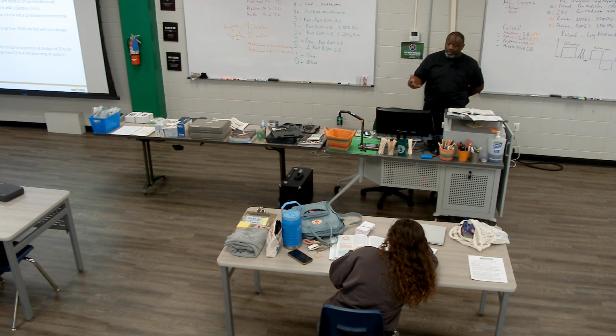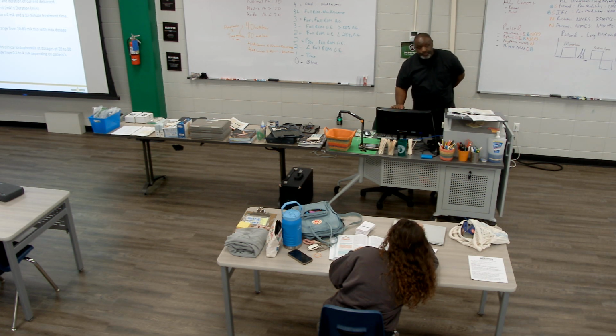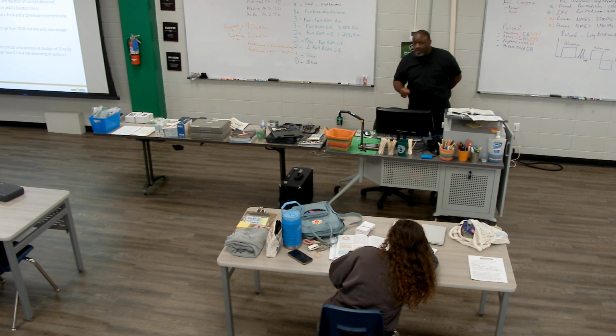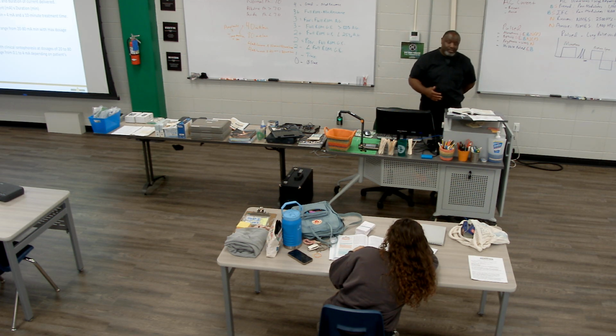Do you have somewhere to go? Because you're going to be here a while. So the machine adjusts based on patient tolerance. If they can't take but 2 milliamps, they'll be there for 20 minutes, because 2 times 20 is 40.